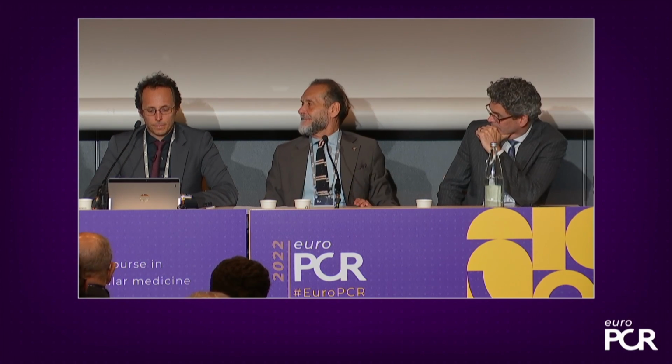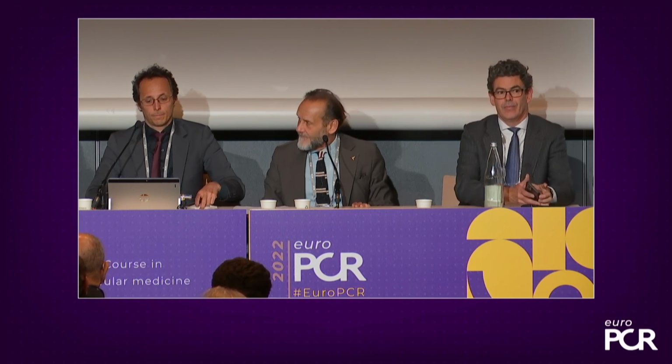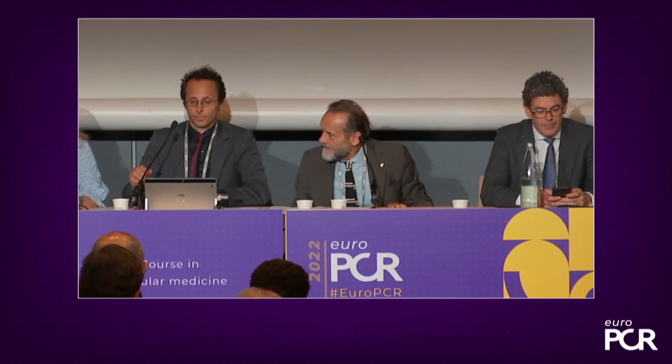No, that's true. I didn't mention this here, but it's true. Even myself, in the majority of my cases, I use my IVL balloon to modify my vessel compliance, to make my microfractures, my cracks. And then still, especially in very tough cases, and this was even a mild case in a way, if it's more calcified and over the whole length, then I like to go after with a non-compliant balloon, like a 6 or 7 millimeter, a ZMED balloon or a Mustang balloon, to get really the maximal luminal gain, and then you go in with your introducer sheet.